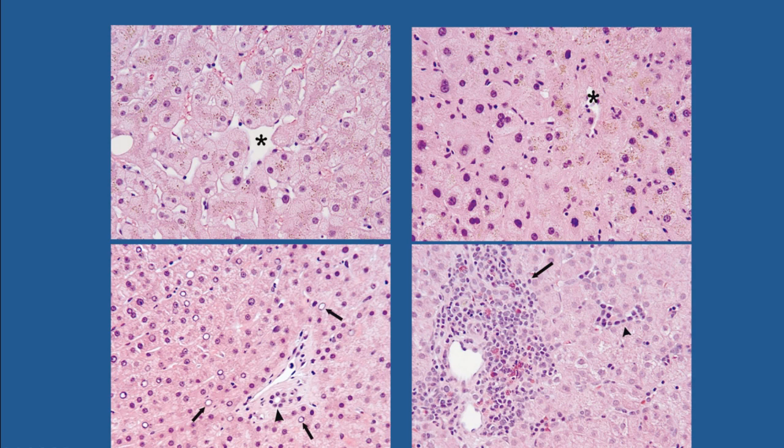So this sort of goes hand in hand. It's not only in older patients. I just want to say that you might also see these multinucleated cells sometimes as the effect of drugs that block the mitotic activity of hepatocytes, for example, methotrexate. So binucleated and multinucleated cells are commonly seen in patients who are on methotrexate.